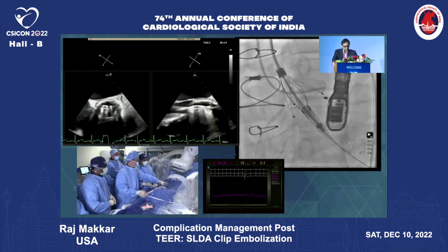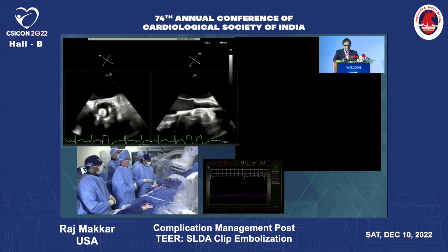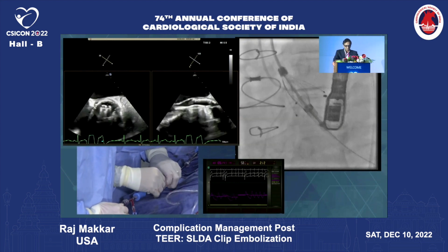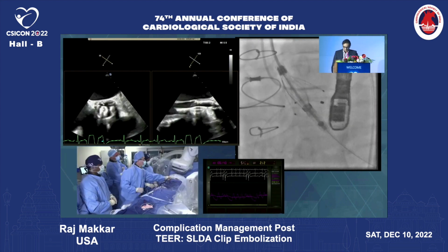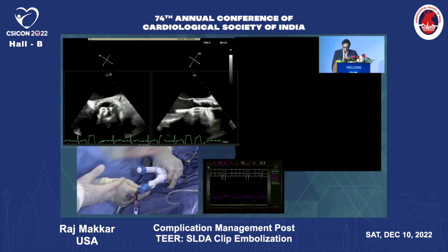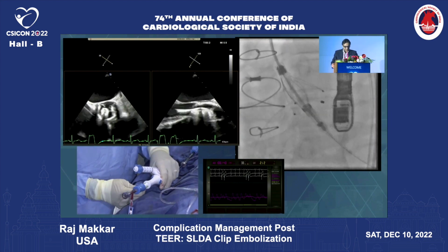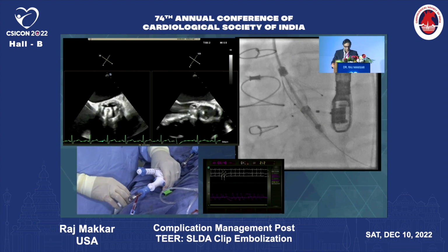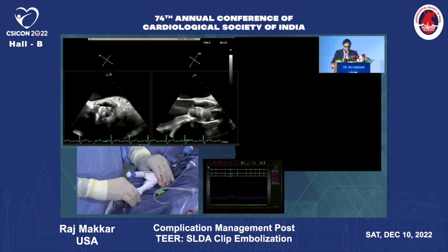So we are going to do rapid pacing. And we are going to, of course, bring our multi-purpose back, which is a ritual, so that we are not trapped. So at this point, we're going to remove the safety clip, and we're going to release the valve with rapid pacing. So go ahead and pace again, please. 170.